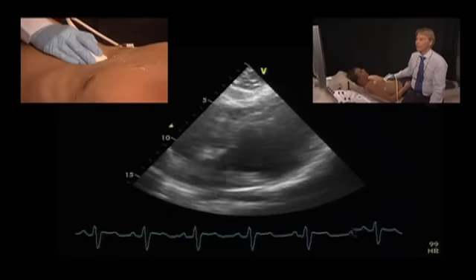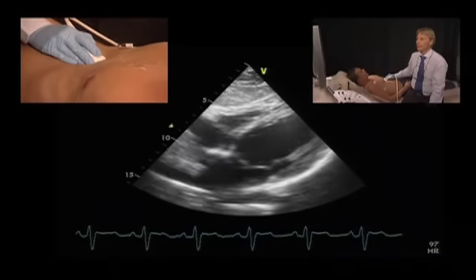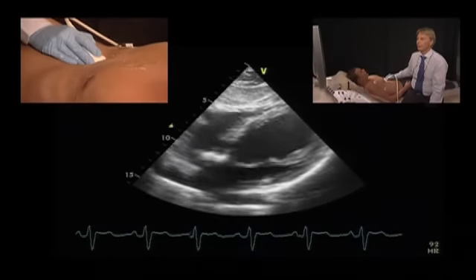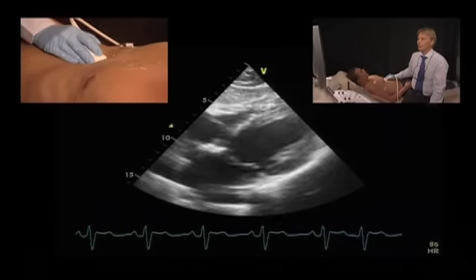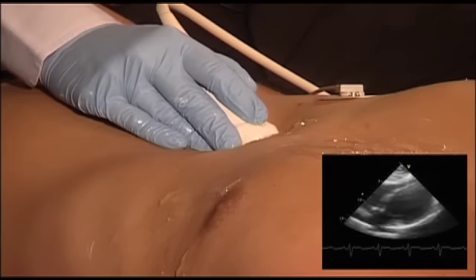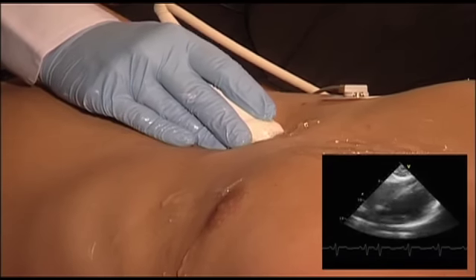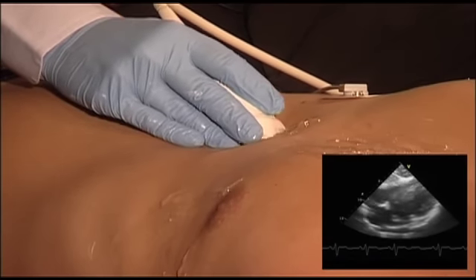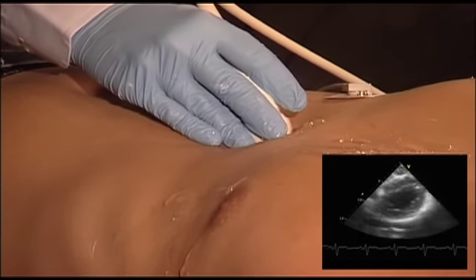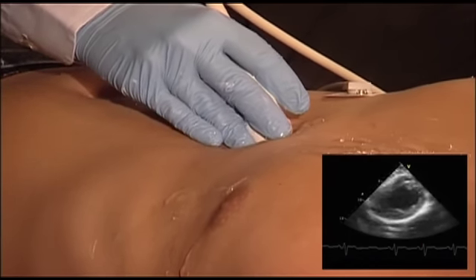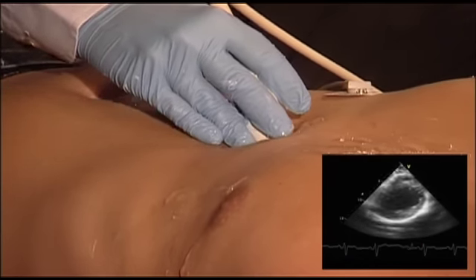From the sub-costal four-chamber view, all you would have to do is rotate the probe counter-clockwise — asking the patient to breathe in slightly — and then you will get a short-axis view of the left ventricle.